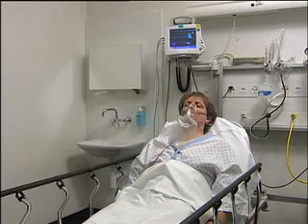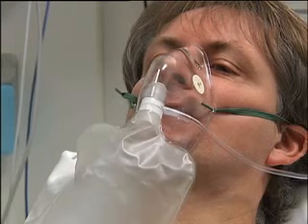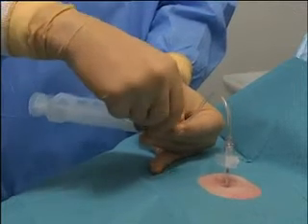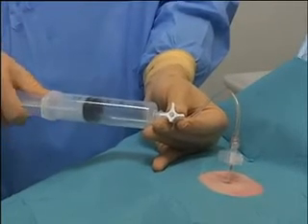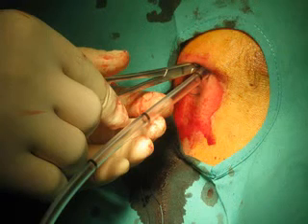Observation and oxygen therapy may be the only treatments that are necessary for patients who have small, primary spontaneous pneumothorax. However, for patients with pneumothorax and clinically significant breathlessness, active intervention is required. This may include needle aspiration or the placement of a chest tube.